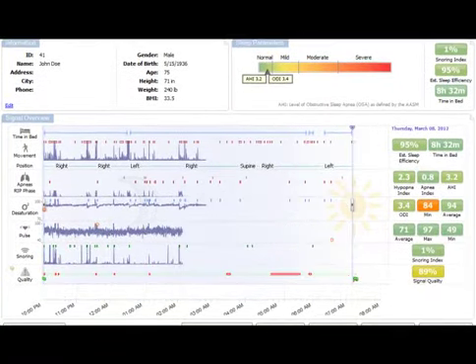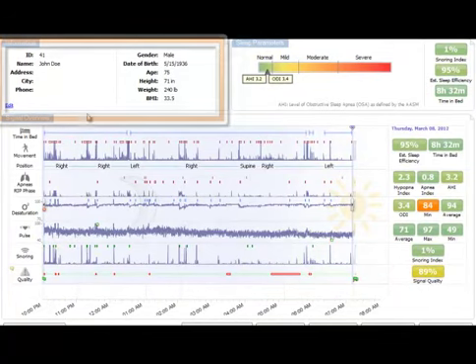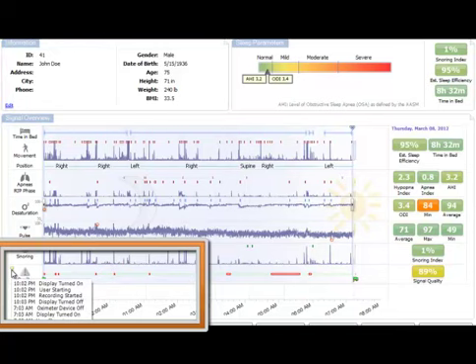If you have the chance, do this while the patient is there. Be sure to confirm that this is their study, then do a mouse-over on the quality to confirm it's a good study, and do a mouse-over on the call-out to make sure there are no unusual log file entries.